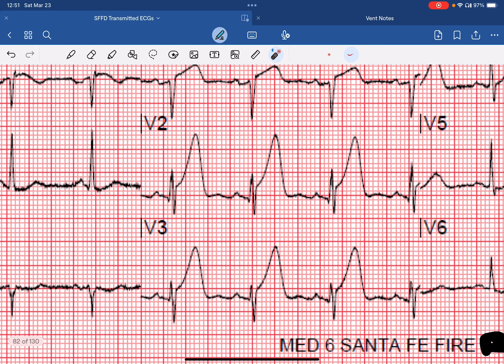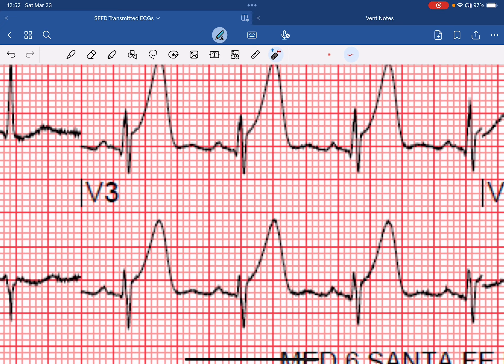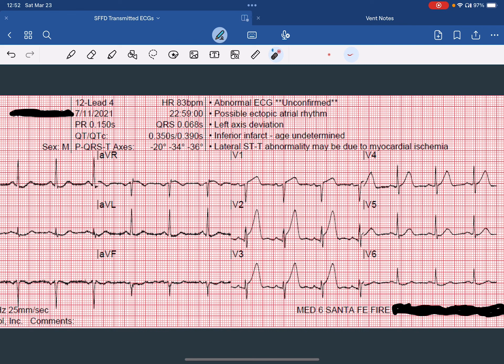Moving down to lead V3, we can see that there is — one box, two boxes — 2 millimeters of ST elevation as well. It is in a contiguous lead because V1, V2, and V3 are contiguous with one another. V1 and V2 are more of your septal leads, and V3 is when you get into your anterior leads, but they are considered contiguous.